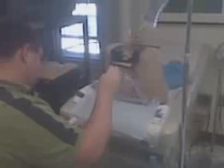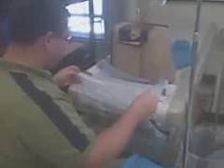We're finished with that. Put the sharps where they need to go. We take the drape off, tell the patient that they're finished with the injection. I want to lie them down. I want to watch for signs of hypotension. Any other problems? Certainly, toxicity from the anesthetic would be a good idea. Shortly thereafter, we'll be able to finish him for surgery.